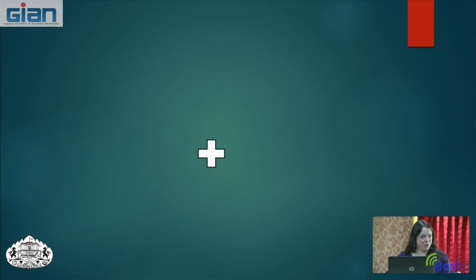Okay, so that was our first block. This is in a block design. You could see those were angry faces, right? And interestingly enough, we try to get rid of all the other cues. So we just try to keep their facial expression in there. And sometimes people have a hard time telling male and female on some of these faces.